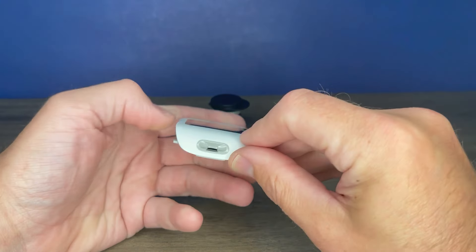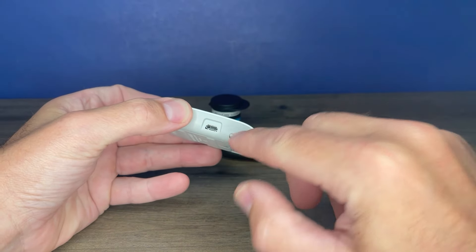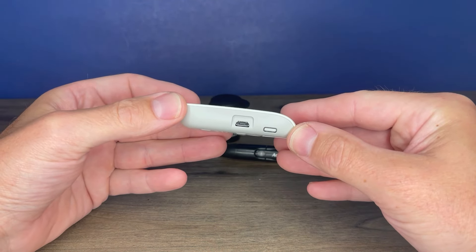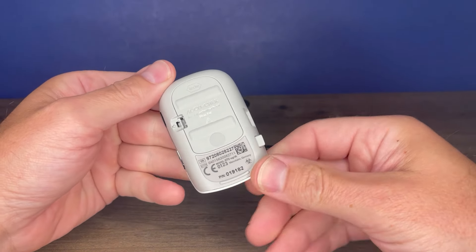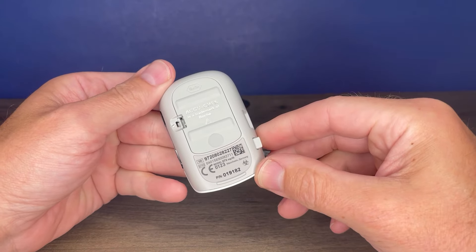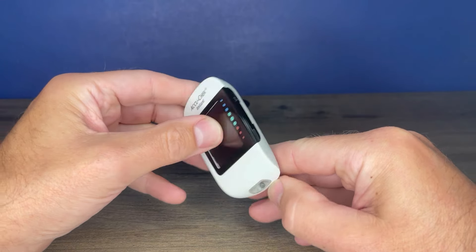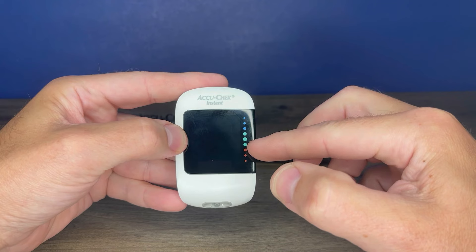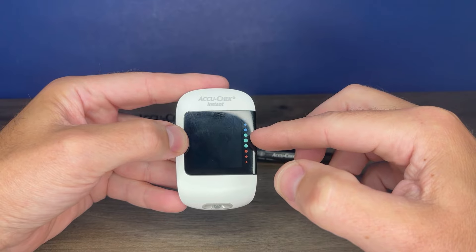The meter itself — the test strips go in the bottom in the slot right there. There's a test strip eject button located on the side as well as a USB port. The USB port is used to connect to a computer; it does not charge the battery. There is a battery door on the back, and it indicates the units your readings will be in. There are up and down arrow buttons on the side of the meter. On the front of the meter, these color dots indicate if your reading is in the target range or not. It defaults to 70 to 160 as the target range.